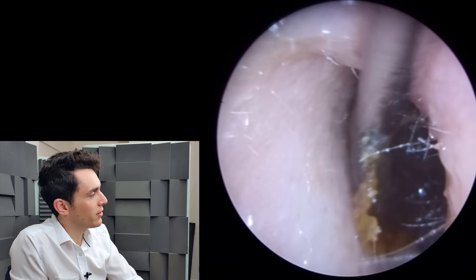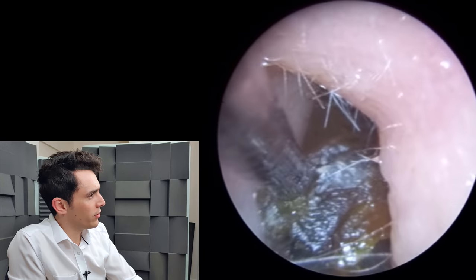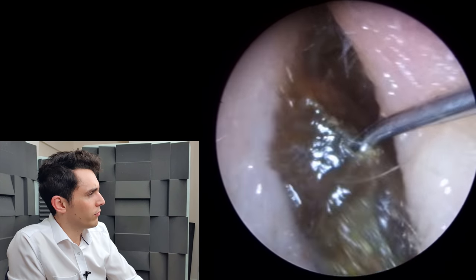At this point I just thought, sod it, I'll get it with a Cawthorn hook. So we go back in — and because it's so hard and crusty, it's much better and more convenient to get it with a hook. There we go. And voila.